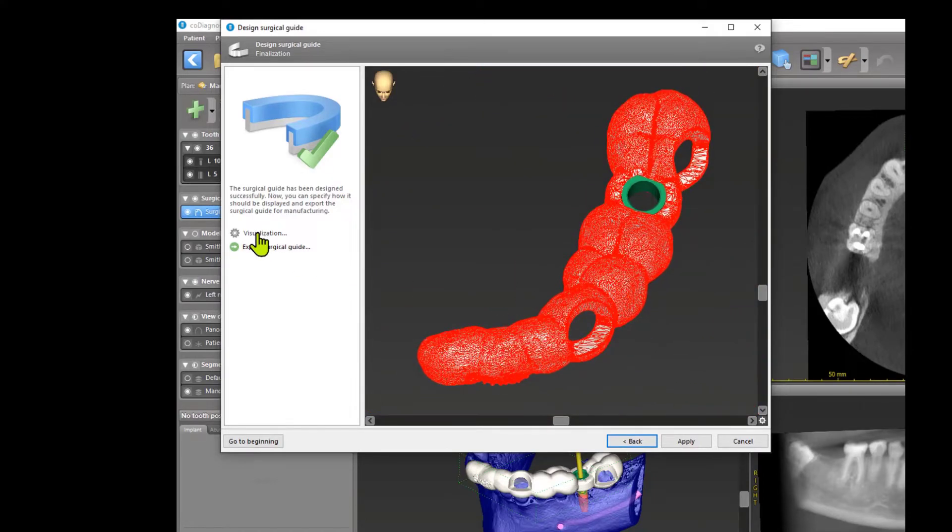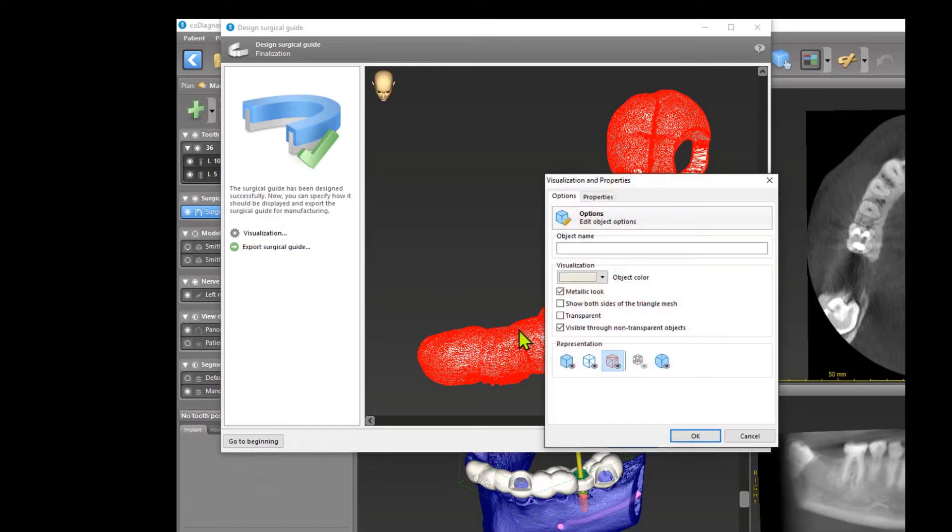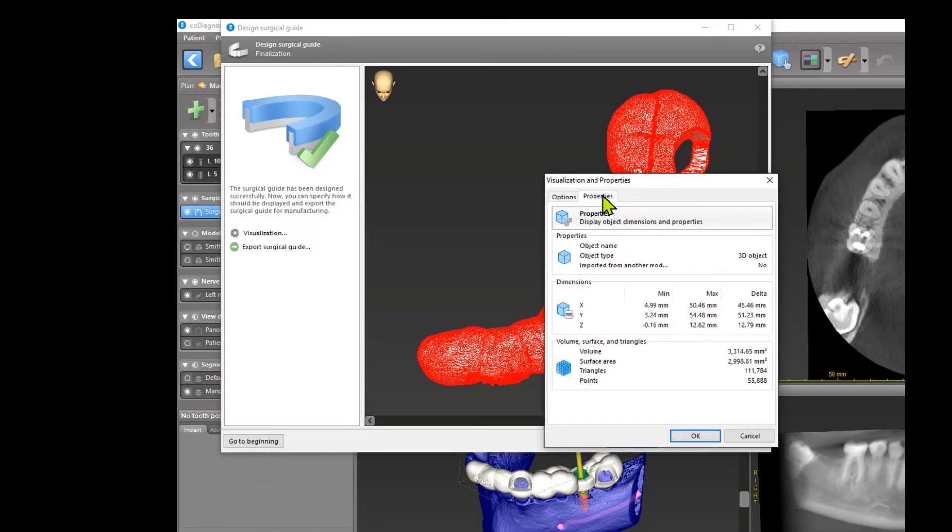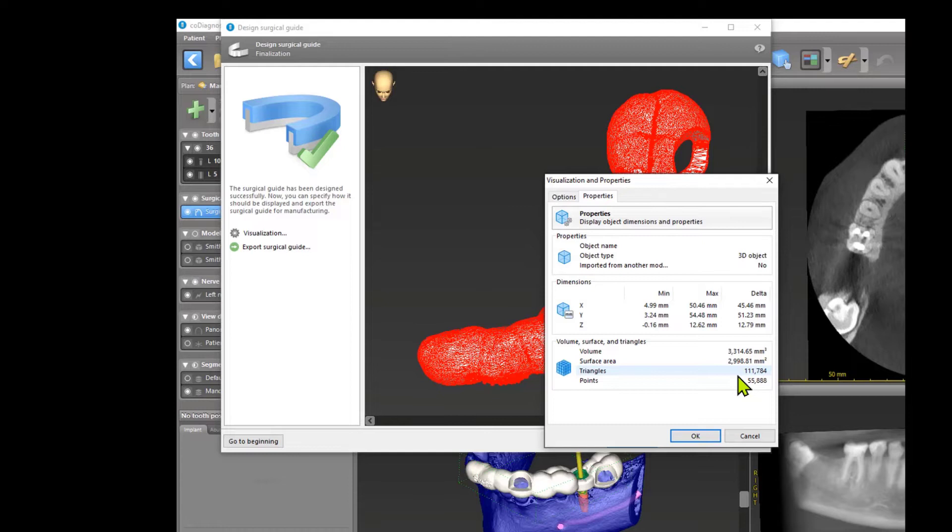And another possibility, if you want to know it, maybe it's interesting. Go to properties and you see my guide has 111,000 triangles and a volume of 3.3 milliliters.